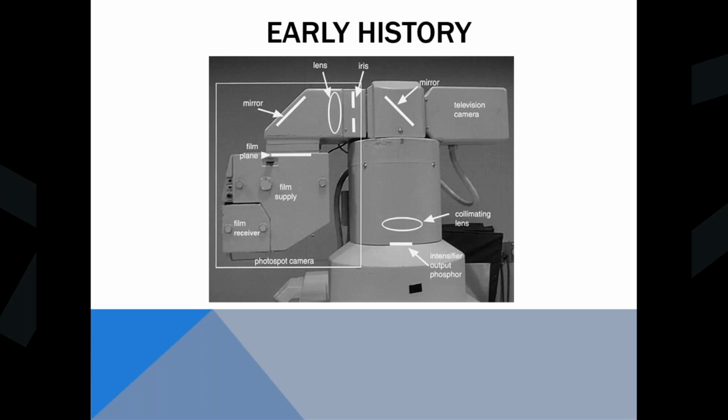screen. Now here's where I was talking about the Hollywood movie cameras, that they would then connect to the other side. You would put film in it, and then you would film it like if you were filming a motion picture, except it would be black and white X-ray. And then from here, you would take the film out, and there was a special film developer just for cinematic film.